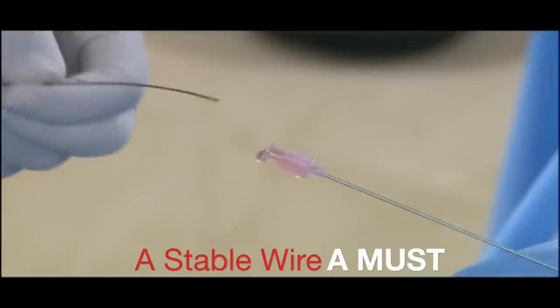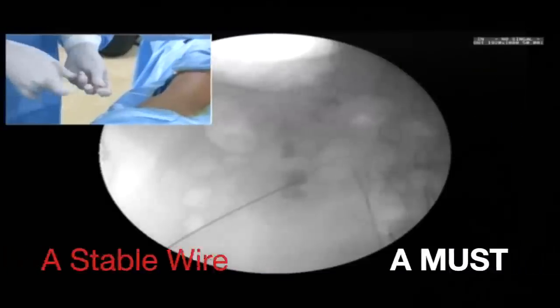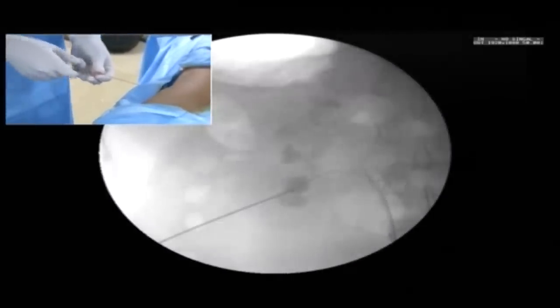Now the second important part is to get the wire across. I am using a Terumo wire and I will have the sister keep flushing saline very slowly. Do you routinely use this wire? Yes, I always routinely use this wire. Now you see it has gone into the kidney, and I am trying to manipulate it into the ureter. Dr. Shabir helps by injecting saline. Excellent. With this I can say 50 percent of the job is done in a PCNL. I hope you will agree. Totally agree.